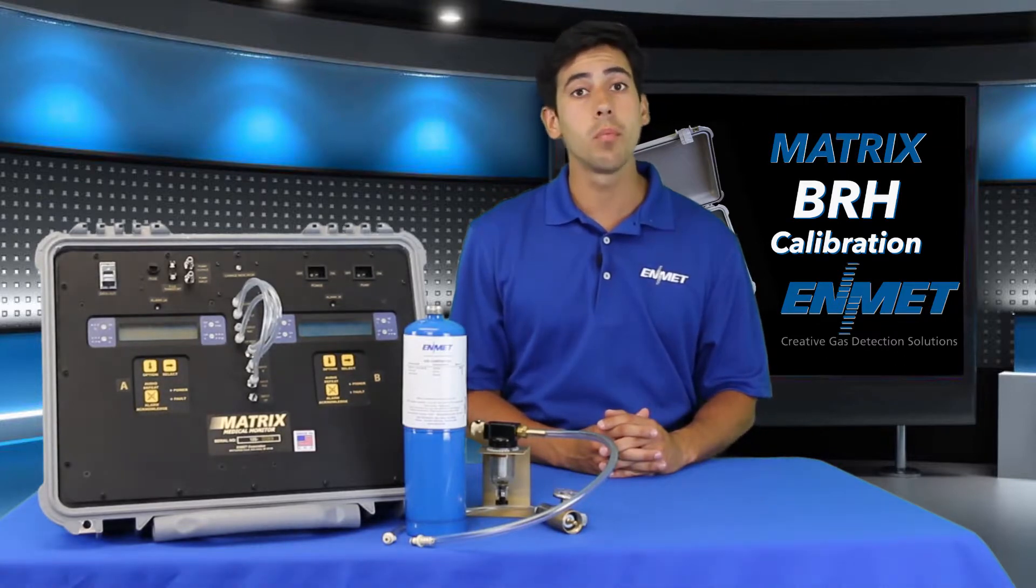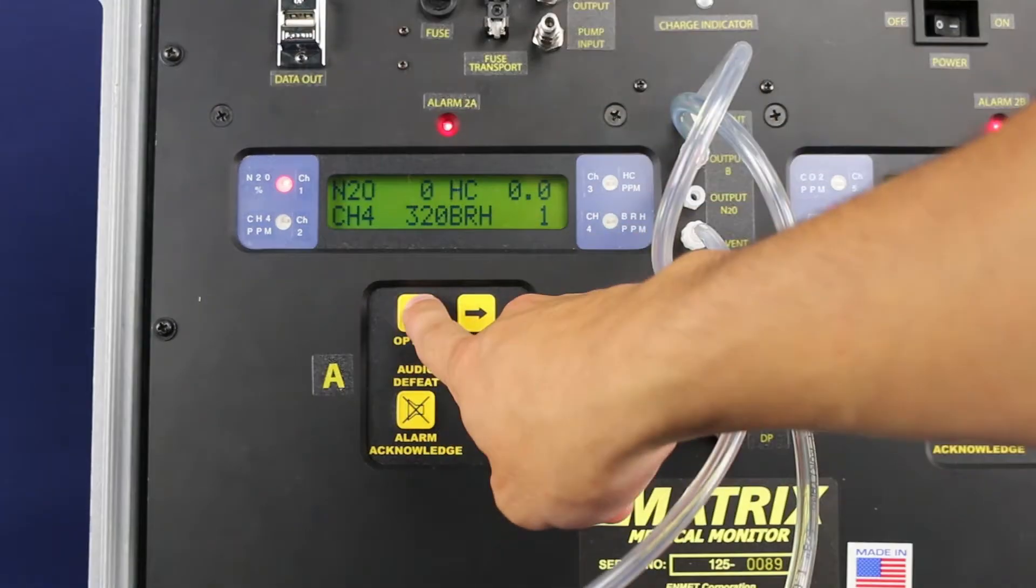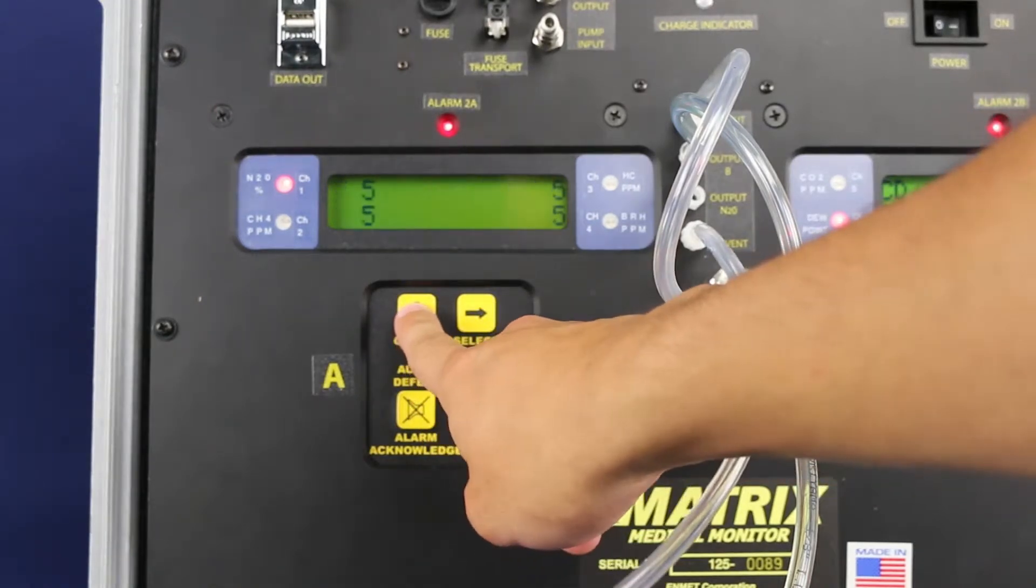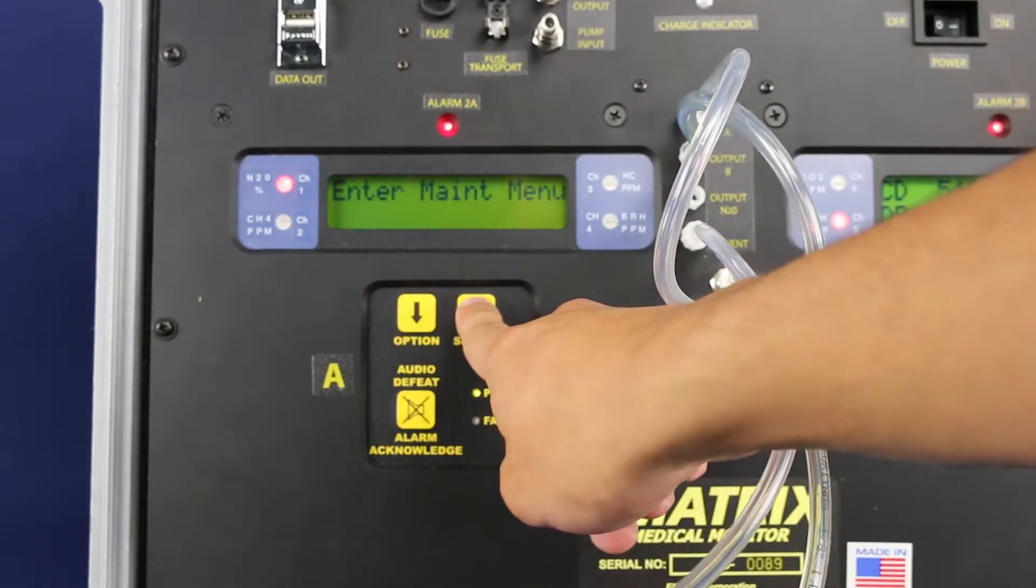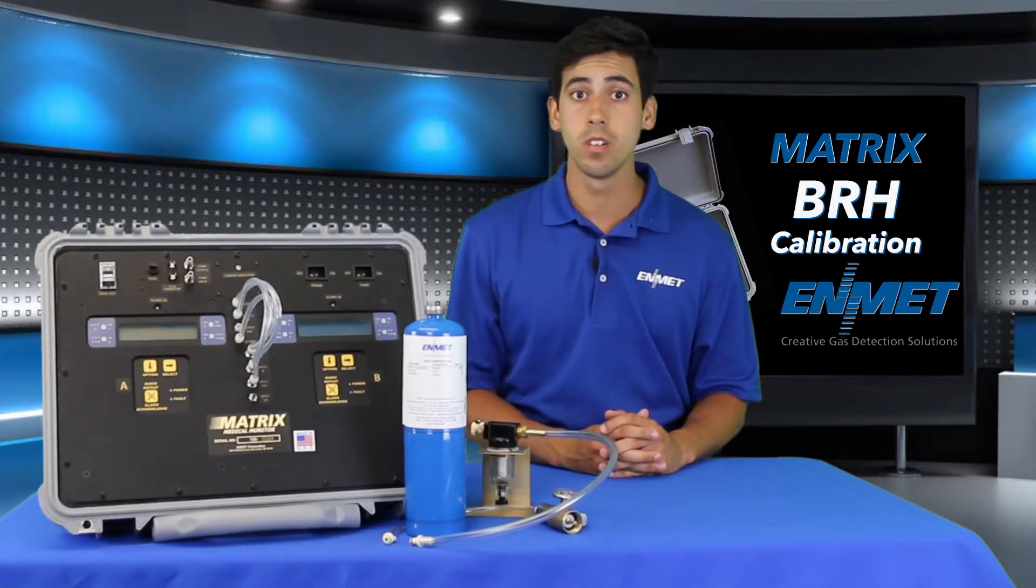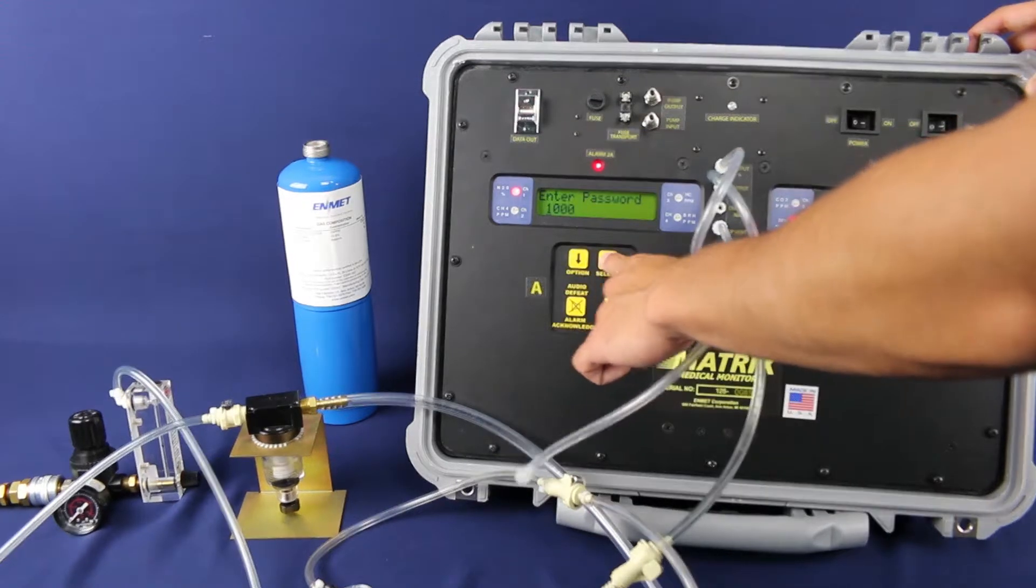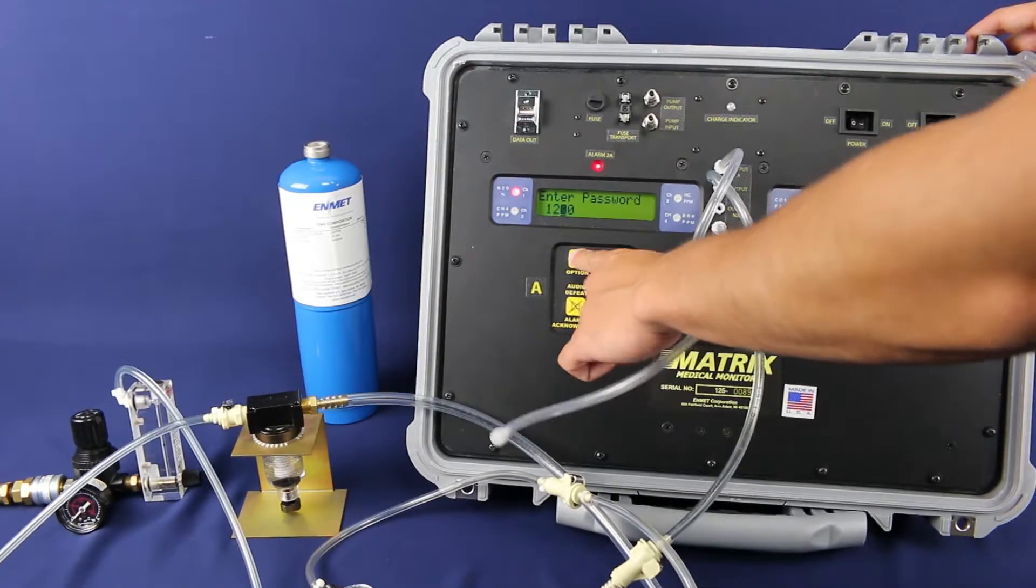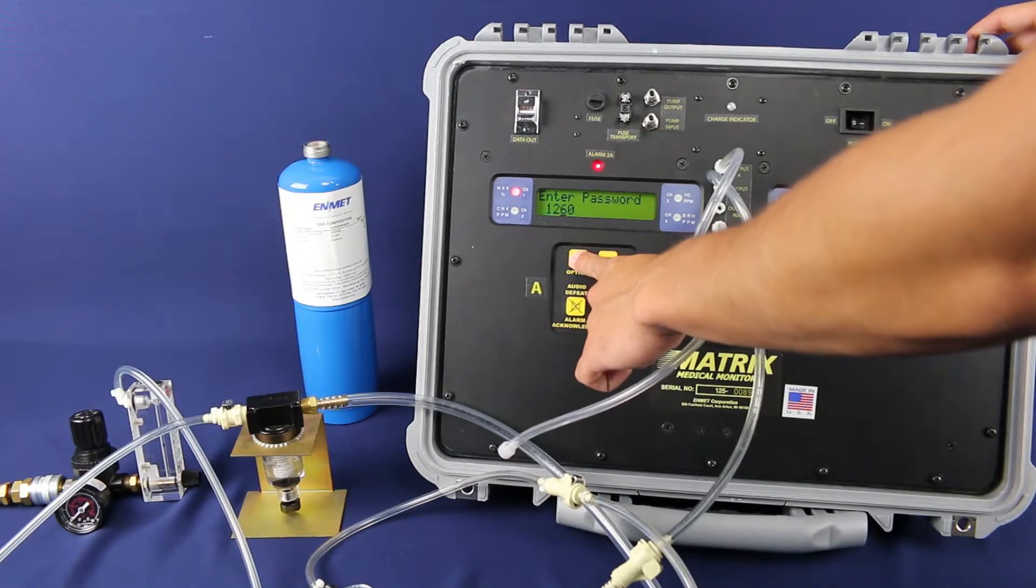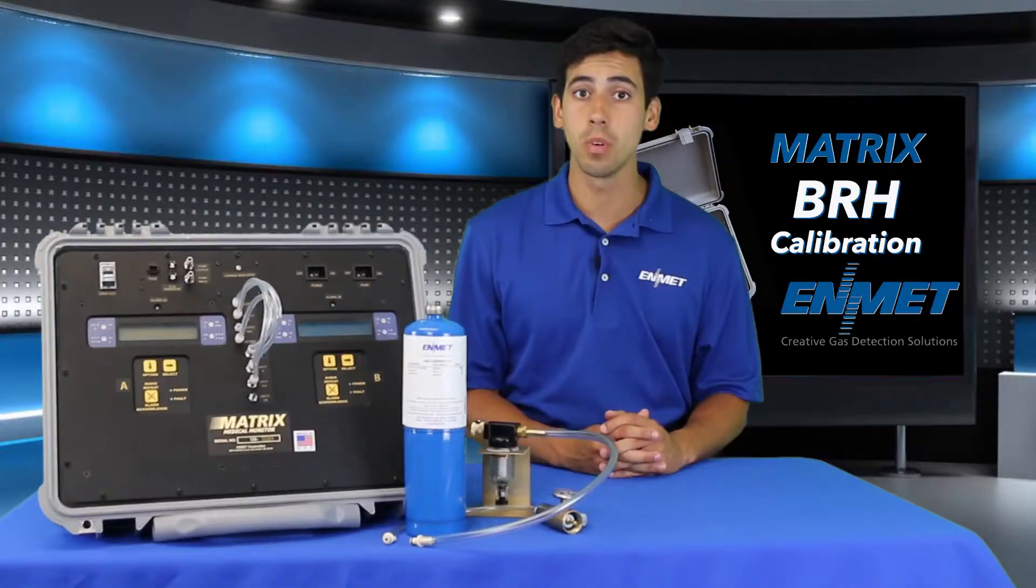To begin the calibration procedure, you'll first need to enter the maintenance menu. Press the option button until enter maintenance menu is displayed, then press select to enter the maintenance menu. The password you need to enter is 1270, which is the default password. If that one does not work, you may want to try 3663, which is the alternative password.